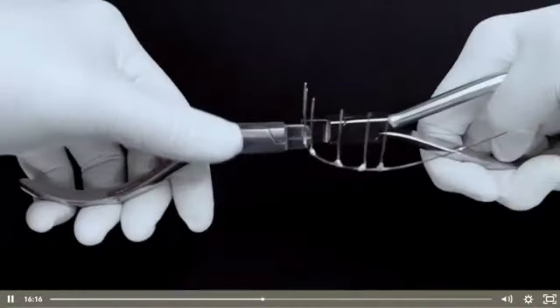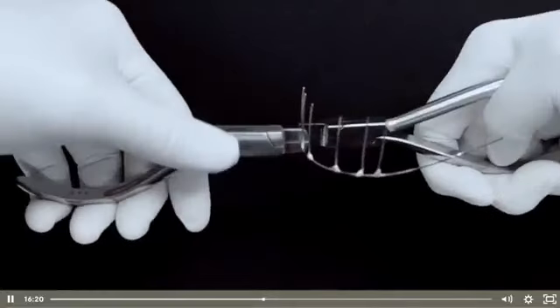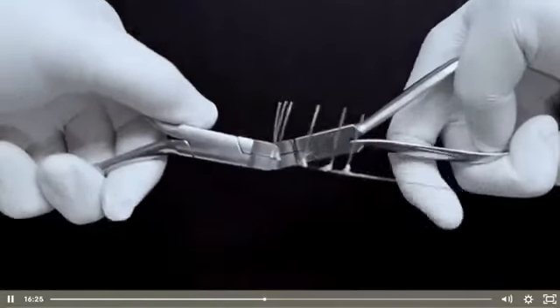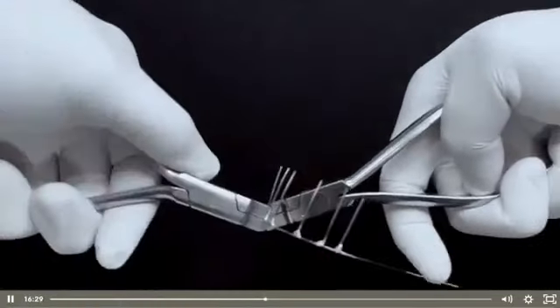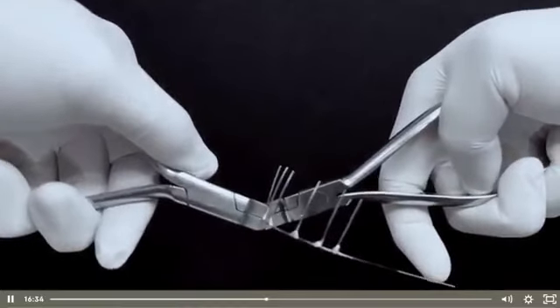So people think that they are doing this using this strategy here. With two pliers, I'm grabbing the anterior segment and rotating the anterior segment towards a positive inclination. But look at this. You are not really applying a torsion in the anterior segment.